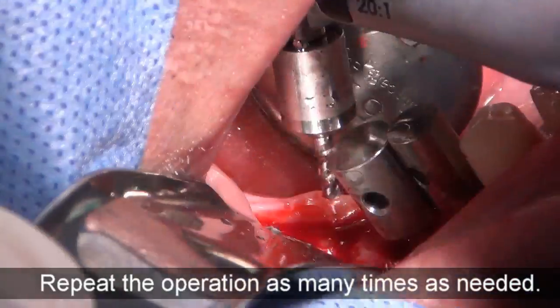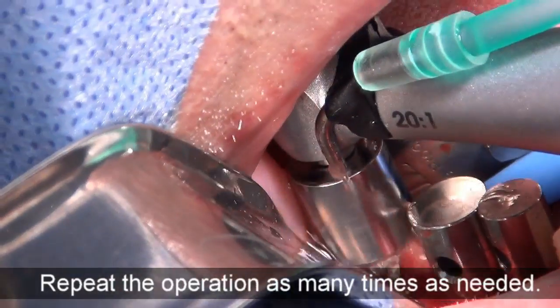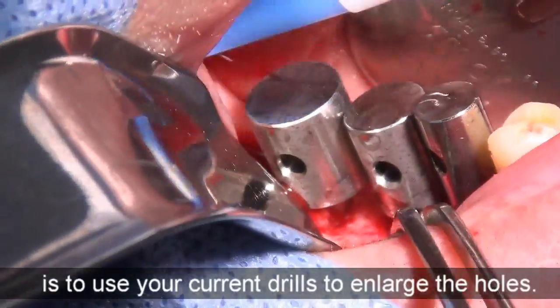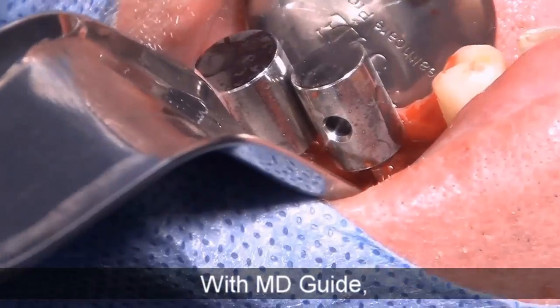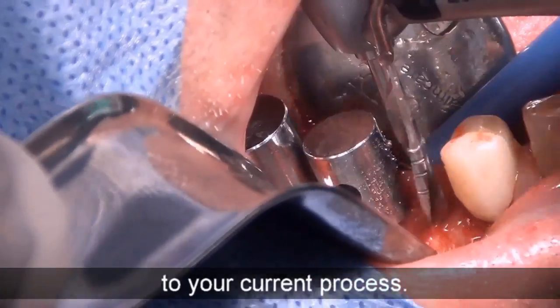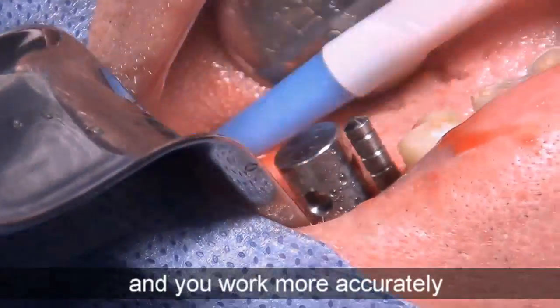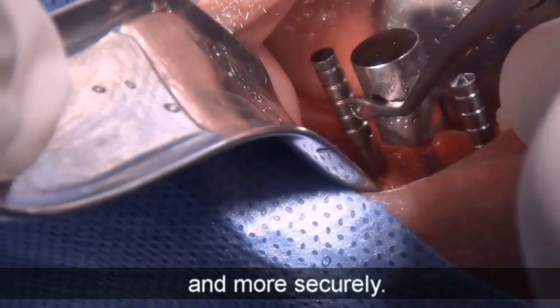Repeat the operation as many times as needed. Now, all you have to do is use your current drill to enlarge the holes. With MD Guide, you don't have to change anything to your current process. You don't need any surgical guide, and you work more accurately and more securely.